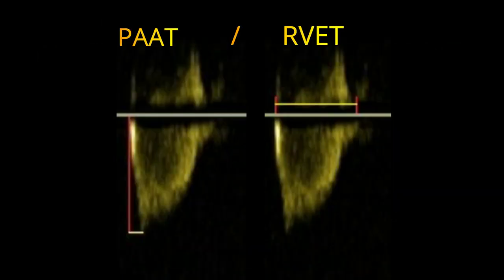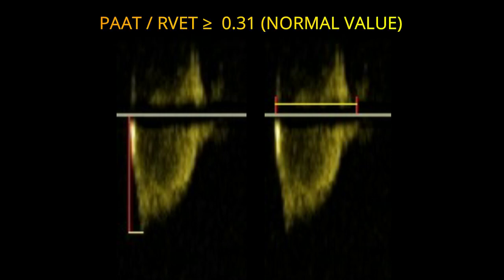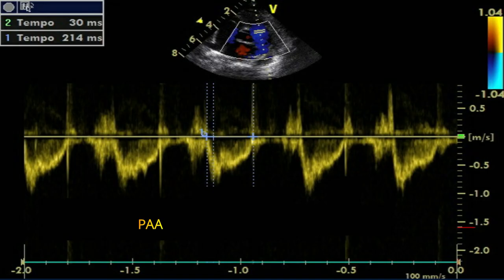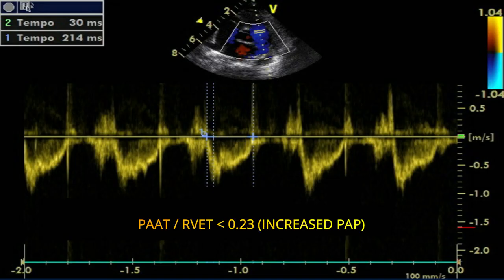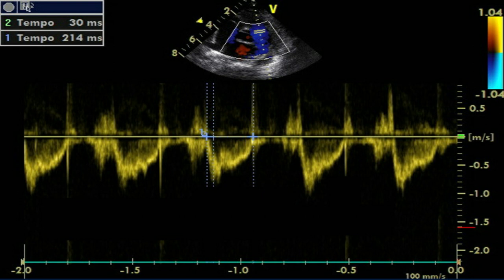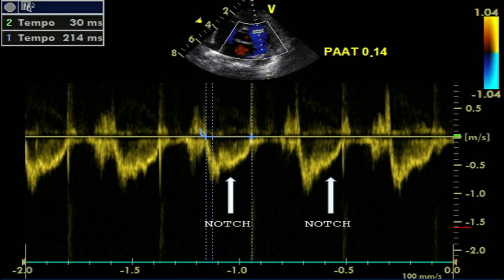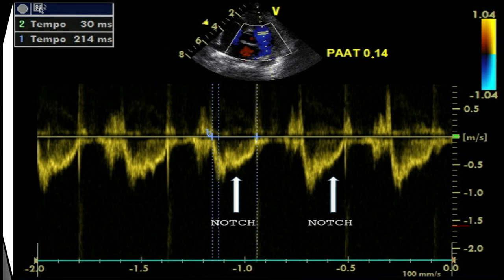The normal value of the pulmonary artery acceleration time to right ventricular ejection time ratio is approximately 0.31 or greater, while a ratio less than 0.23 indicates increased pulmonary arterial pressure. Visual inspection of the shape of the Doppler flow envelope pattern across the right ventricular outflow tract is a sensitive predictor of pulmonary hypertension and right heart dysfunction. The mid-systolic notch — also referred to as the flying W — is associated with elevated pulmonary vascular resistance and pulmonary arterial pressure.